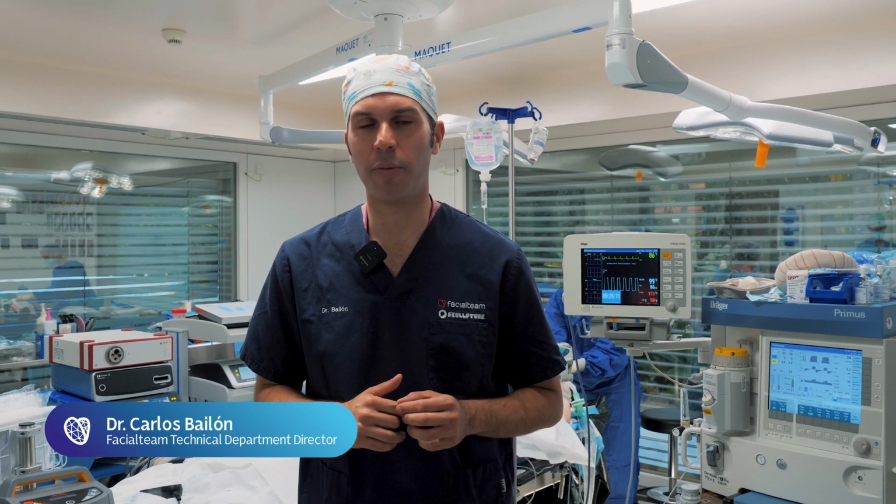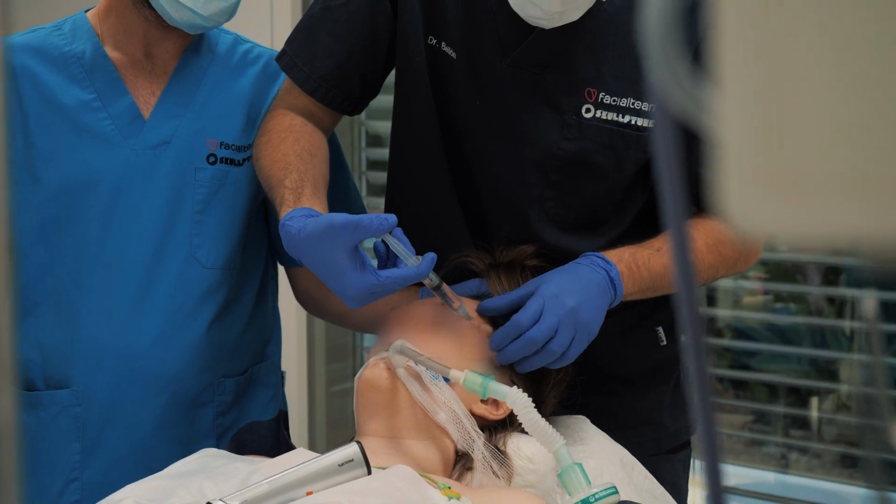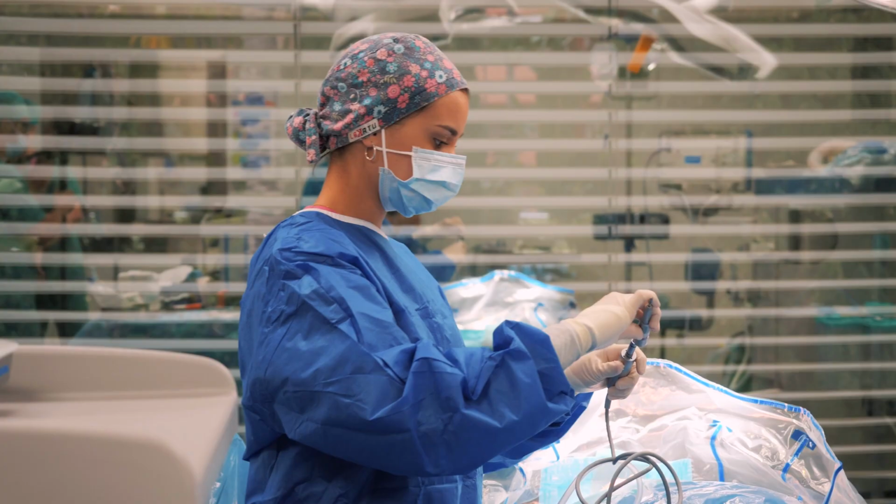Hi, my name is Carlos Bailon and I will be one of the surgeons today in the operating room. I have prepared the approach for the forehead contour technique and put in local anesthesia. The nurses are preparing the surgical area now.